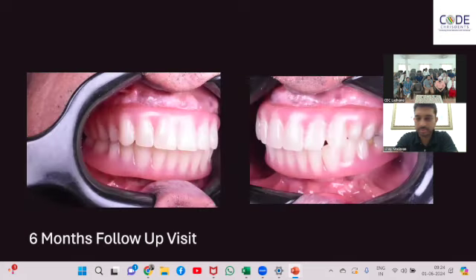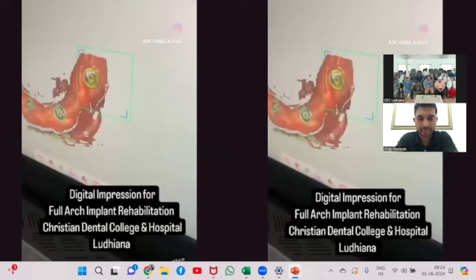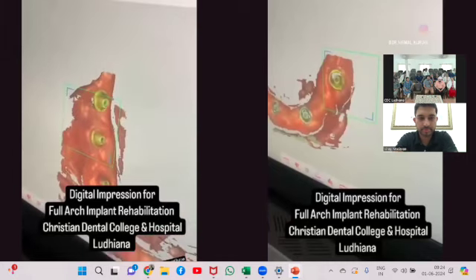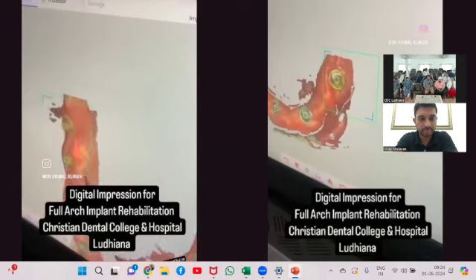Right. This is at the 6 month follow-up before we removed the acrylic. This is the occlusal view of the maxillary and mandibular, no fractures, pretty good. And the OPG, I forgot to put the OPGs in place, shows very good bone healing with very minimal bone loss. So we went ahead with removing the acrylic. He was here for only 1 month. The time was a little tight.